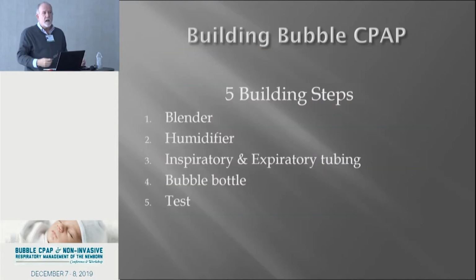All right, so I broke it down into 5 steps. Yep, 5 steps. Starting as I do from a therapist, I tend to work from the wall, past the baby, to expiration. Some people work from the baby back.